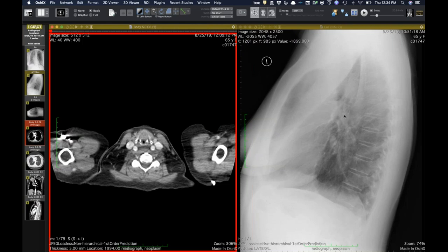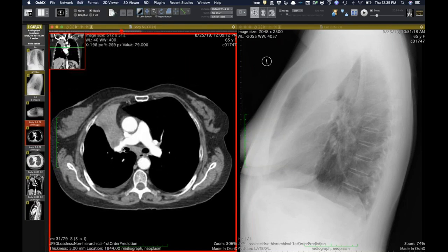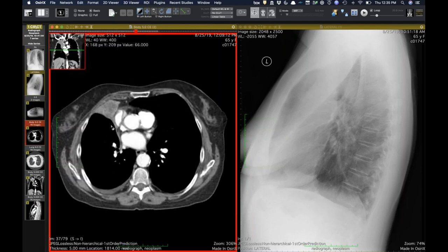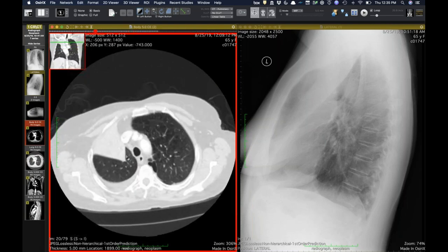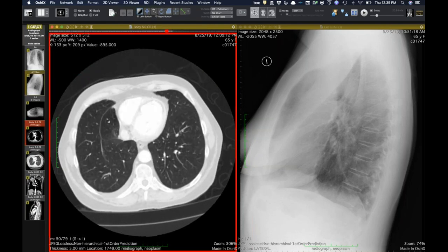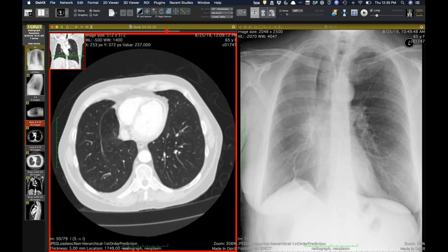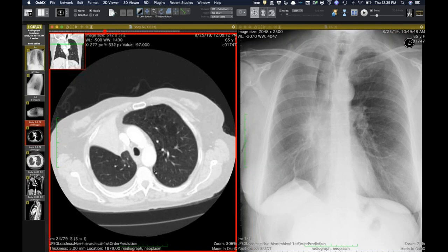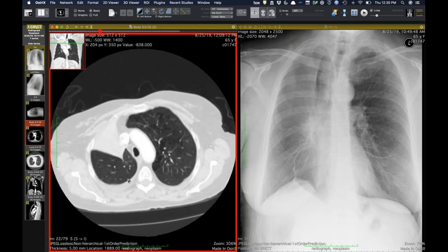There's loss of the intermediate stem line, and you can see the right upper lobe and right middle lobe are both knocked out. There's a very nice loop sign on the right side here — pointing to the V that generates the loop sign right there. And there's a nice juxtaphrenic peak in this case too — the medial basal segment of the lower lobe, with an inferior accessory fissure, and it's traction on that which generates the juxtaphrenic peak. People still call this traction on the inferior pulmonary ligament, but it's really traction on the inferior accessory fissure.